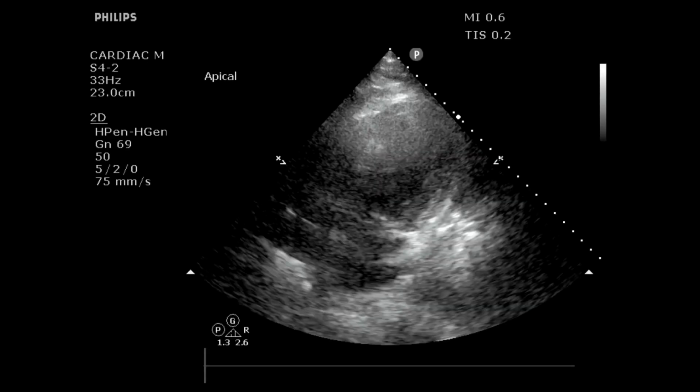And so as we work through the case, we can see in the right clinical scenario, we have someone who's got no effusion, right? It's easy. We have a reduced ejection fraction, and we have lots of pulmonary edema. So this is basically the picture of an LV failure causing that hyperadrenergic drive to get you the flash pulmonary edema. So the take-home message on this one is basically looking at how to assess LV function, right?